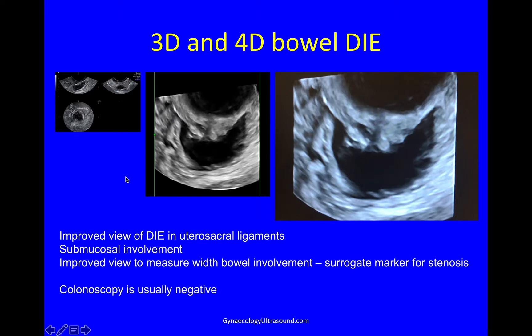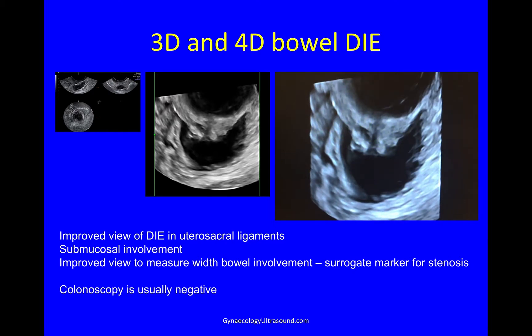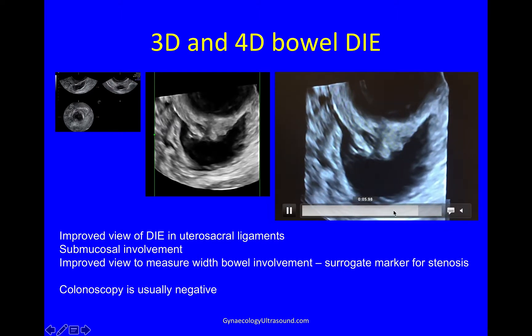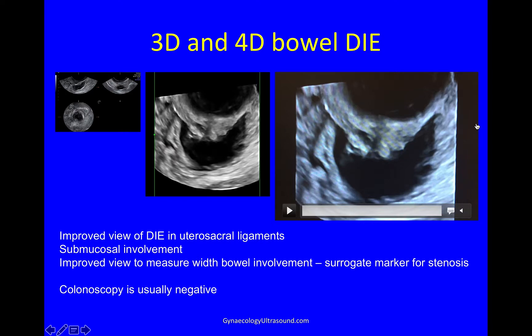You can also do 3D. If you look here at the bowel nodule, I've applied 3D to it and rendered it, and here I've got a nice bowel nodule with the retrocervical nodule attached to it. 3D improves the view of the DIE in the utero-sacral ligaments and gives you a nice submucosal view. You also have an improved view to measure the width of the bowel involvement, which is a surrogate marker for stenosis. Colonoscopy of this lesion is usually normal, so it's very handy to look at it with 2D, 3D, and 4D. Rotating the image gives you a better idea that this very retracted lesion might well be causing significant stenosis.